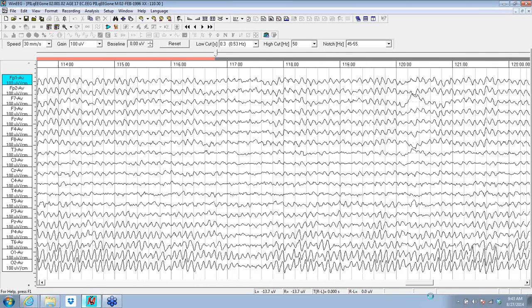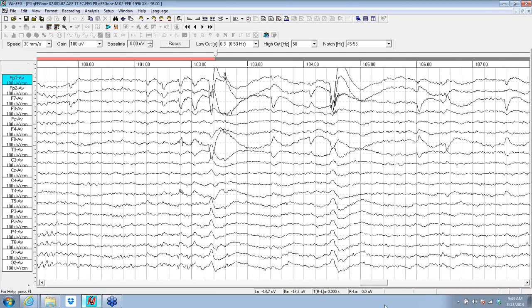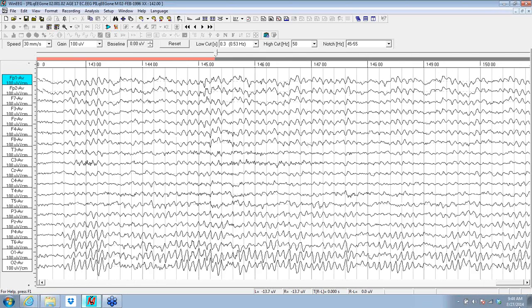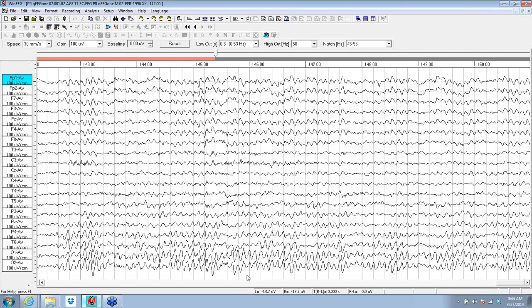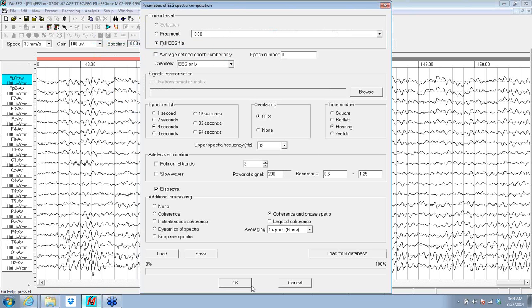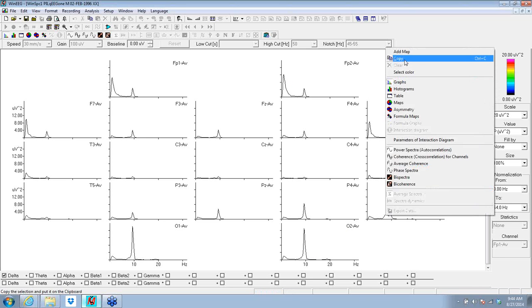There's a lot of lateral eye movement, a little peekaboo here. But the EEG here ends up having a nice persistent alpha. I'm going to analyze this with the eye movements left in it, not taking up the time to take them out. You can see the blinks and the lateral eye movement in F7, F8, FP1, FP2, so the slow end of it is that. But this is the alpha intensity here. And in the temporal area, we have the T6, but we have a slow alpha variant at T6 as well.